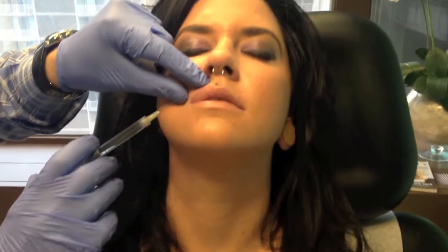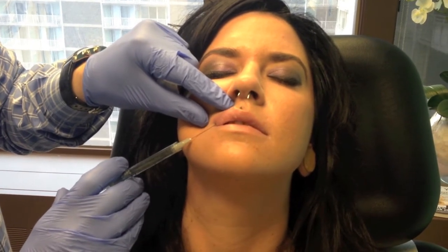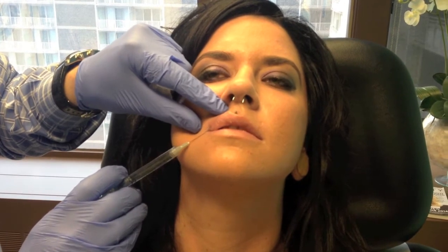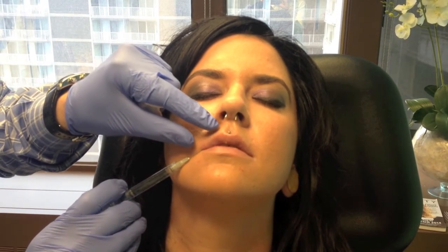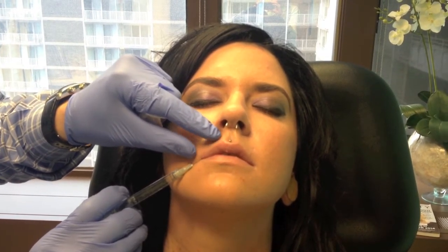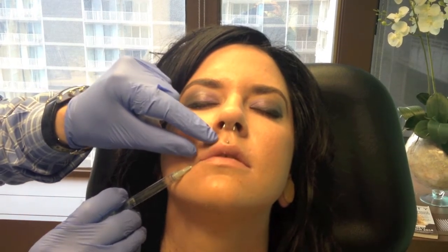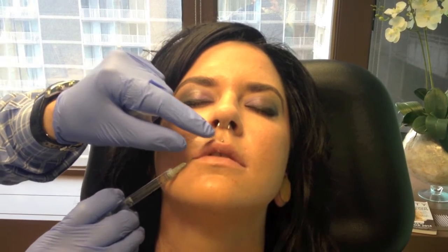I roll the lip out, take the entry point, prime the needle to get a little bit of the Juvederm to come out, and enter slowly. This is the one they feel the most, right at the entry, and then it's a slow progression. I release the lip because I don't want to artificially change the way it looks, and I occasionally roll it out. As I'm pushing, it's an anterograde injection — I'm depositing the Juvederm as I'm penetrating. It usually pushes blood vessels out of the way so you get less bruising, and by checking I can see exactly what's happening.